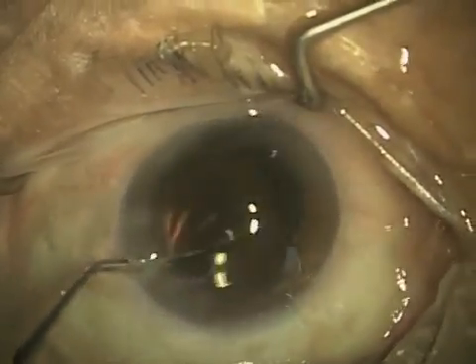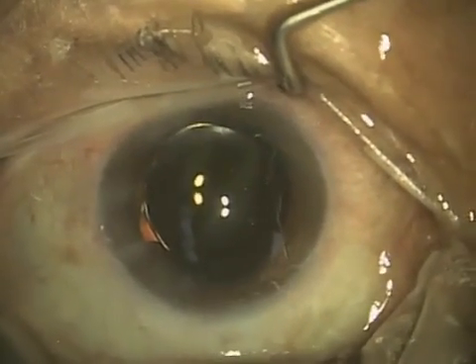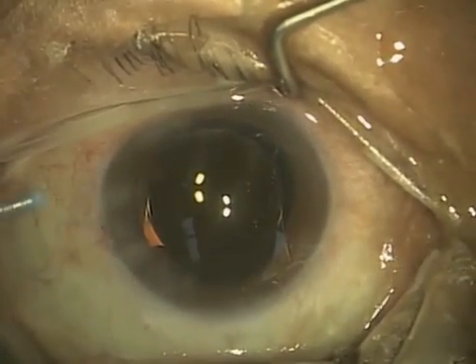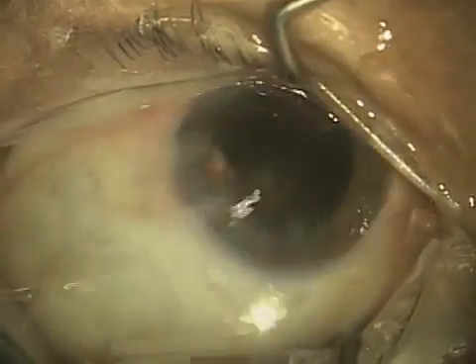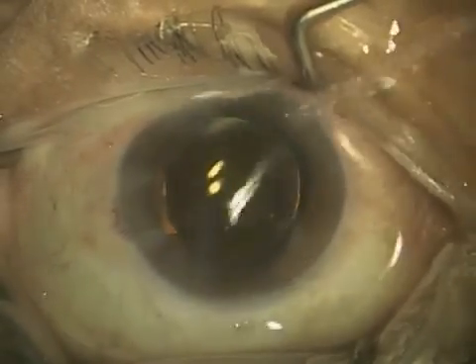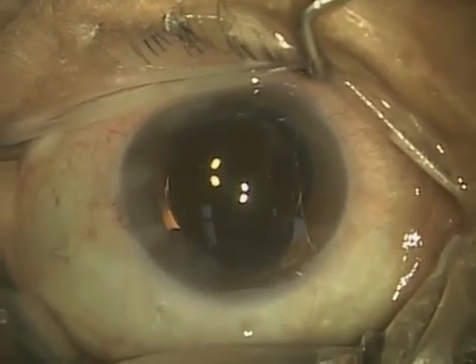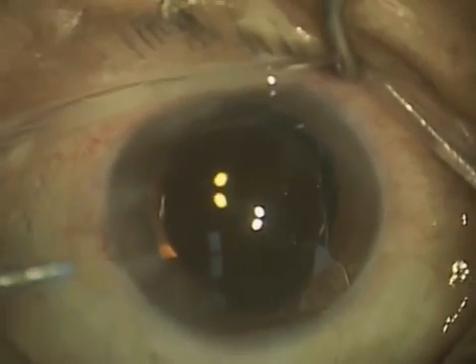Now I'm rotating the lens. It's actually been inserted into the capsular bag, and I'm rotating it so that it's in good position. You can see that the optic goes out almost all the way to the dilated iris, and the capsular edge is actually over the optic edge. It's difficult to see, but there is a little reflection you can see.